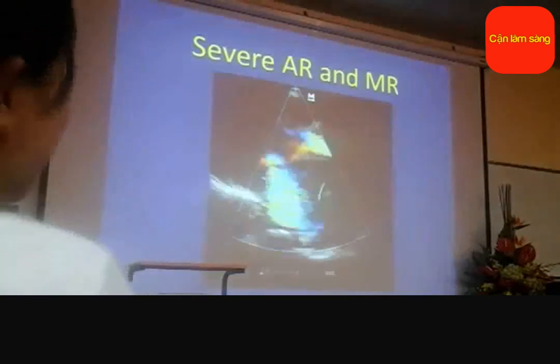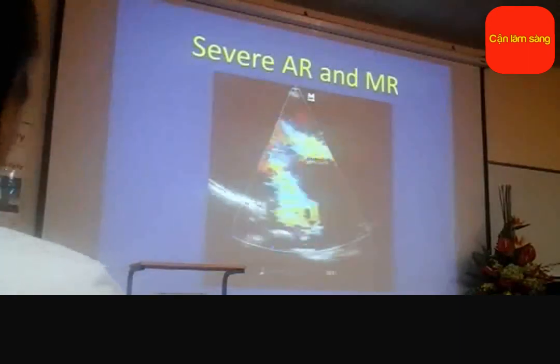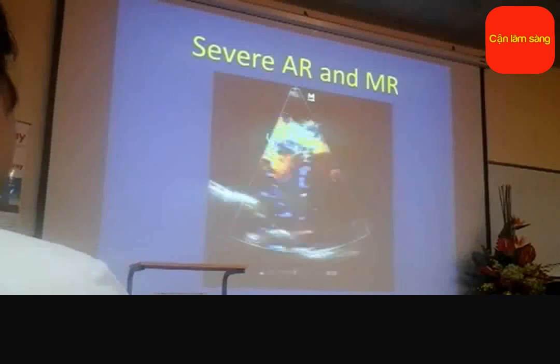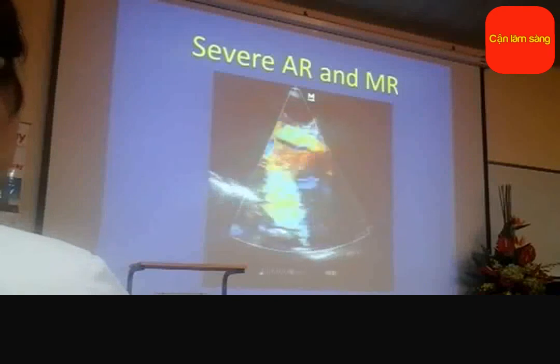So the left atrium is enlarged, a large mitral regurgitation, systolic flow, and a large diastolic aortic regurgitation.